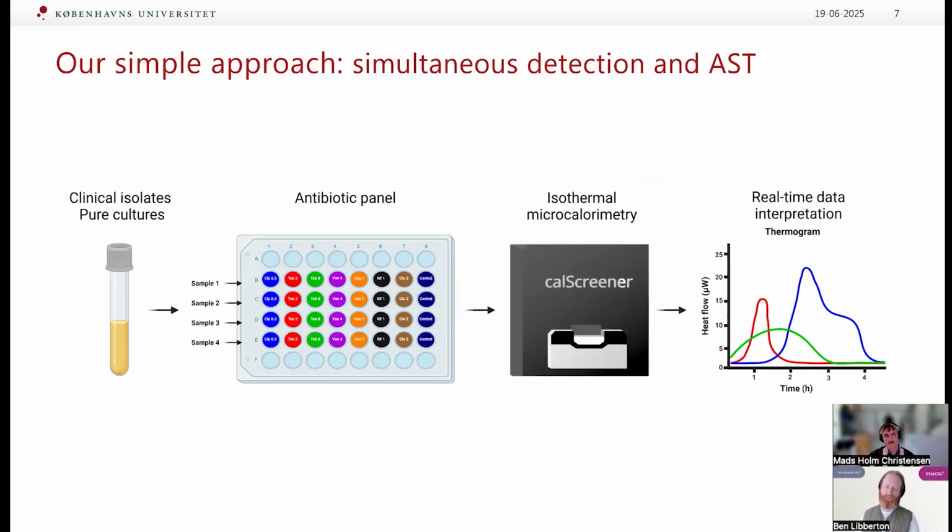But of course, the plan is to make different versions of this antibiotic panel and tailor it more specifically to osteomyelitis infections in general, but also maybe use some of the empiric treatment that they use at the hospital to see whether they should actually use that empiric treatment or not. So it's an ongoing evaluation as well of what antibiotics to use.